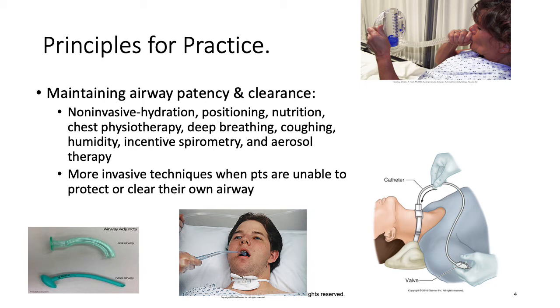Another tool that can be used non-invasively to maintain airway patency and clearance is incentive spirometry. You also learned about this. This prevents atelectasis in the lungs. And always remember incentive spirometry, incentive inhale, so that you're teaching the patient to actually inhale slowly and deeply and hold it for a few seconds if they're able to. And lastly, aerosol therapy is another non-invasive way to maintain airway patency.